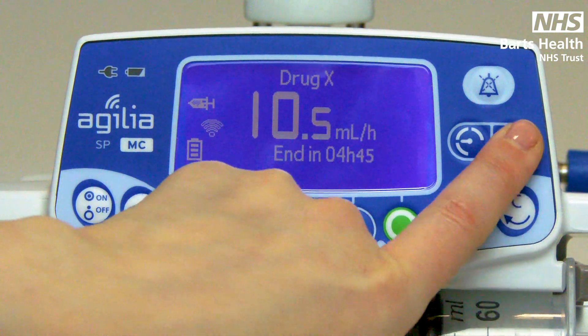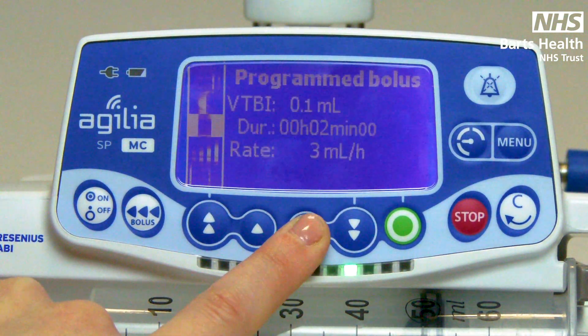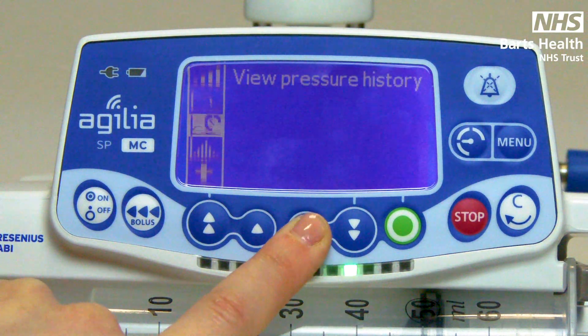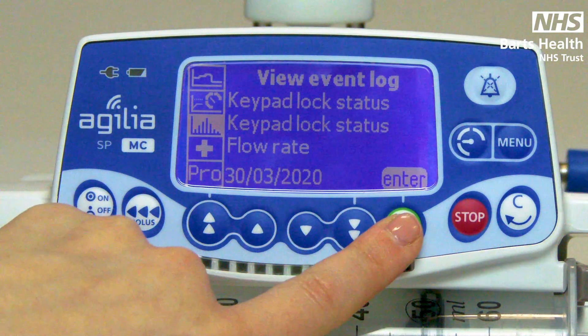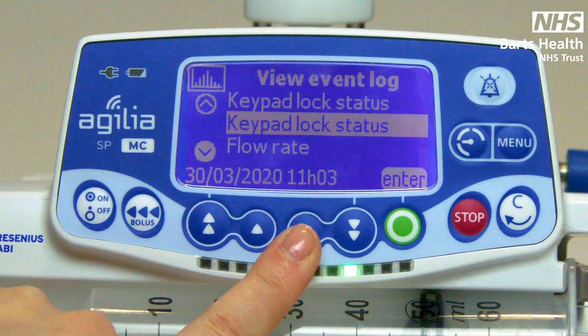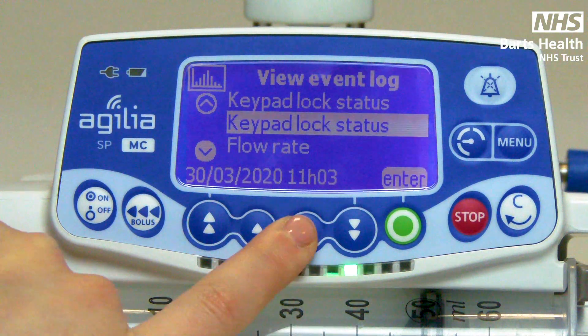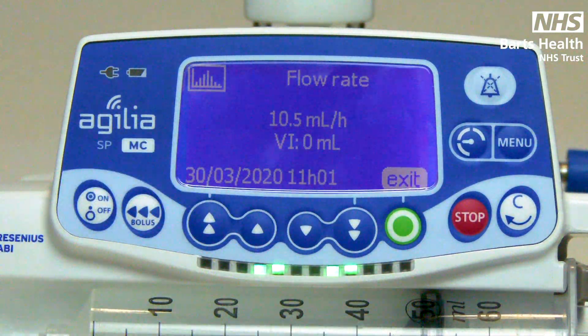For an event log, go to your menu and scroll until you see the graph symbol on the side. The event log will show you all basic input into the pump — for example, times of changes and rates.